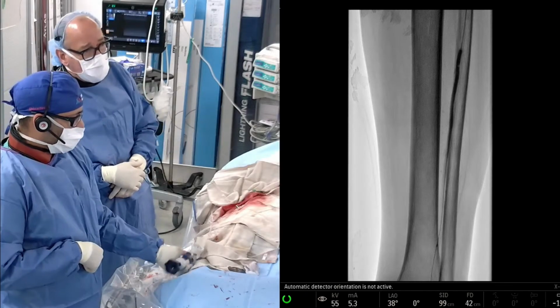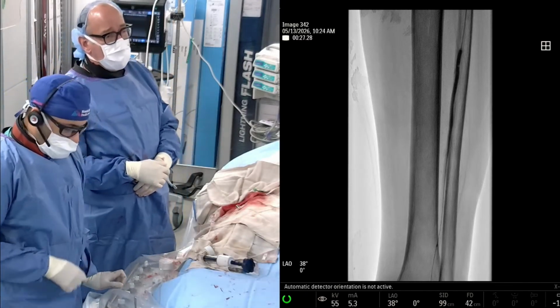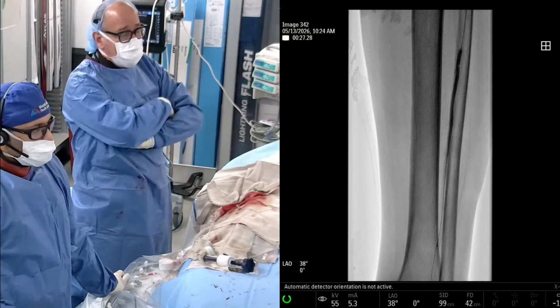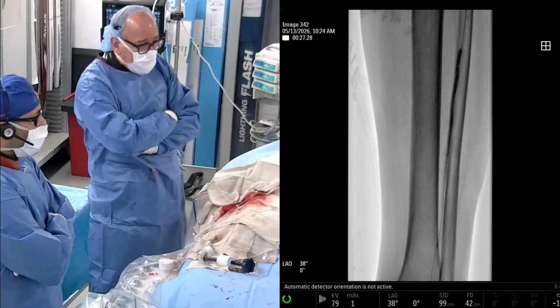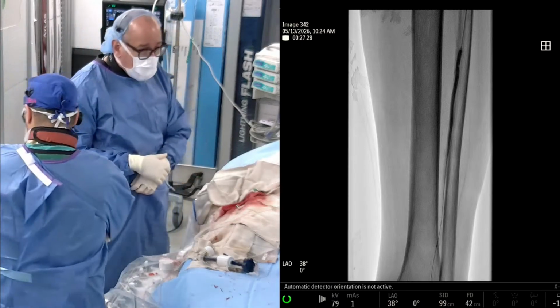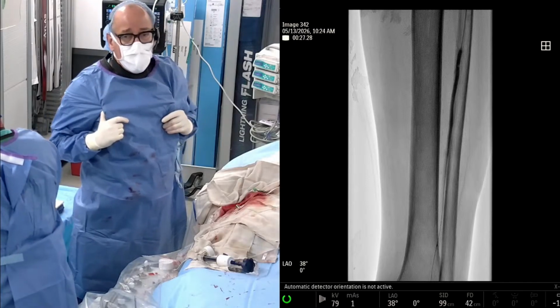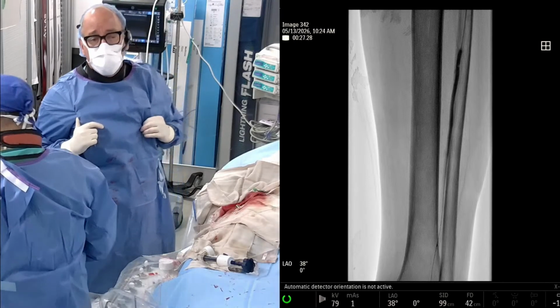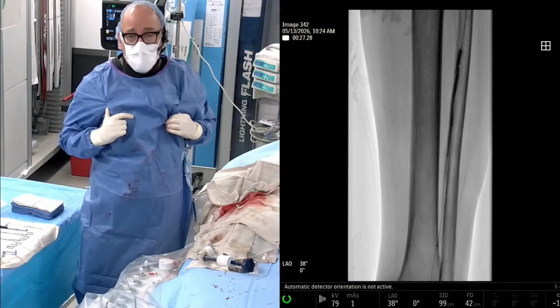We're gonna leave this up for about 60 seconds, and then we will move it up. I don't think I need to go deep into the ankle. I don't think it was affected that severely. And then we'll do another angiogram, but I think we're gonna prep the origin of the AT. And if we could start to prep a 3.5 lithoplasty balloon, that would be great.